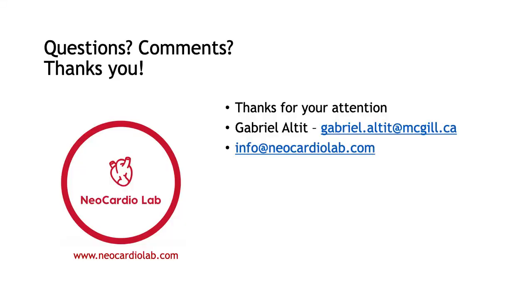So thank you for listening to this module. This is just really an introduction for the basics of understanding the mechanics of pulmonary pressures and their estimate by echo. Echo is an imprecise technology to measure pulmonary pressures, but it gives a good sense in terms of screening. It's something that has no radiation, allows for live evaluation. You can follow your patients actually quite easily whenever you do interventions, and it may answer a lot of questions at the bedside.